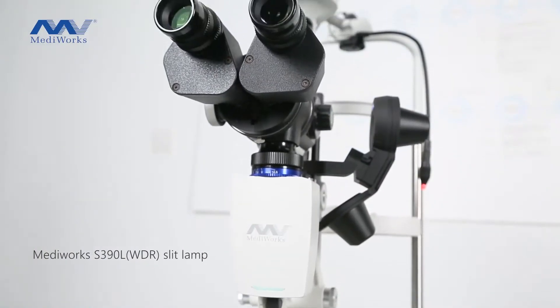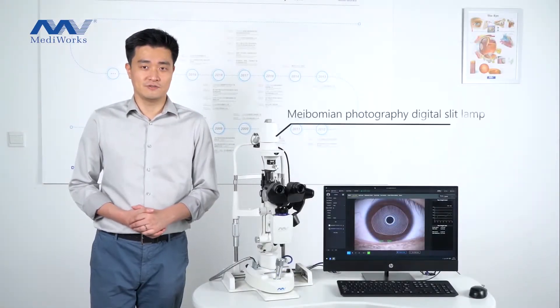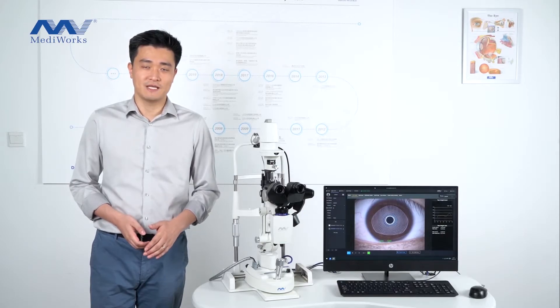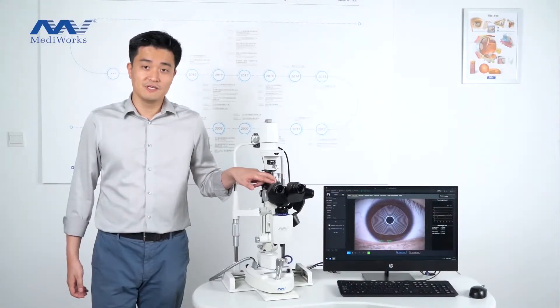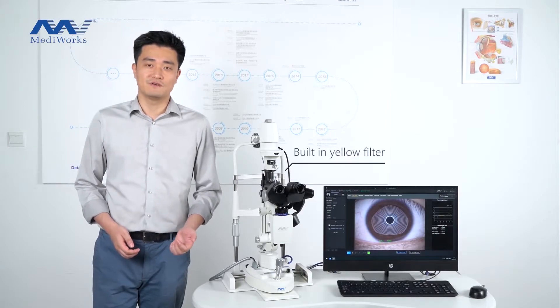This is the 390 Firefly Slit Lamp. It's a Meibomi photography digital slit lamp. It has really good optics. The resolution is up to 200, and you can see the endothelial cells under photo magnification.